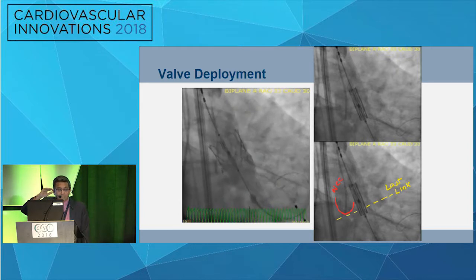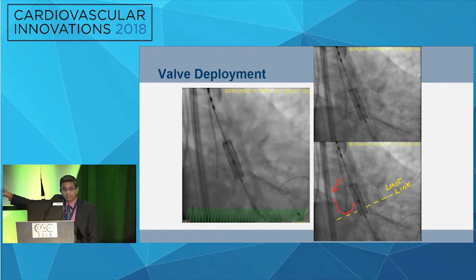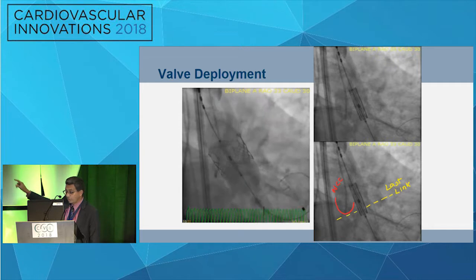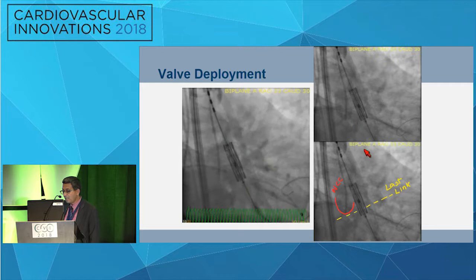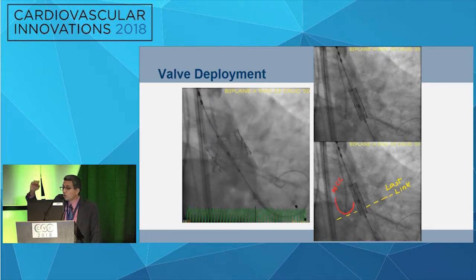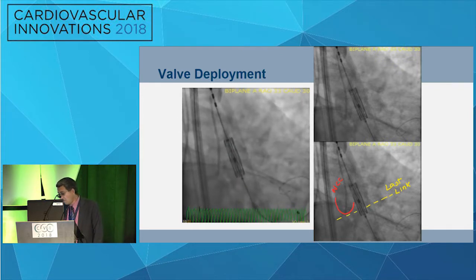You align like how you align a Medtronic valve with the rings, you can align the S3 valve so that you are squared. When you're squared, you see the link. You see the bottom link. You see that white line of the stent. You can see this white line to say that this is the link. If you line up the link, this is how much it foreshortens. It's just lucky that it foreshortens exactly the size of the link. So if you are not going to underinflate it, it will foreshorten exactly the size of the link. So you can just take the link, place it there, and inflate.